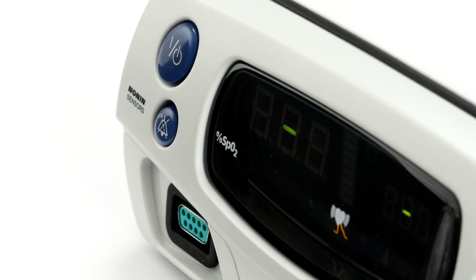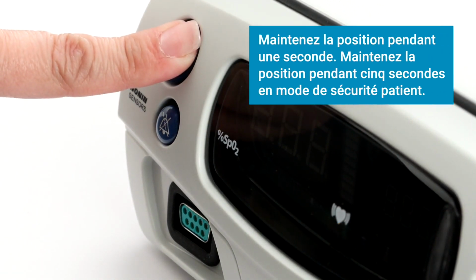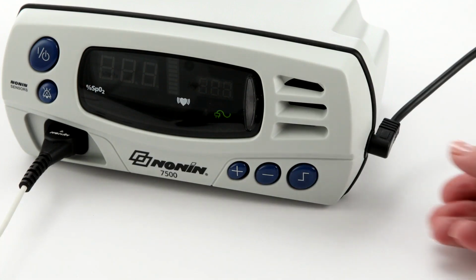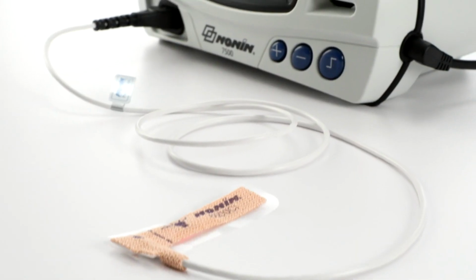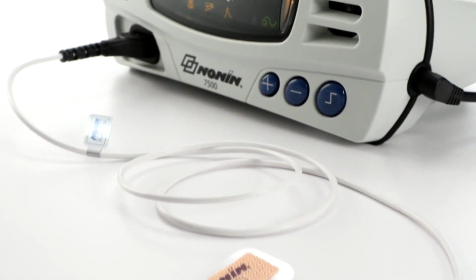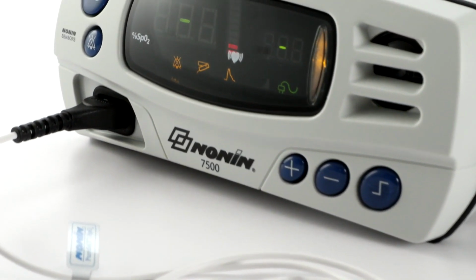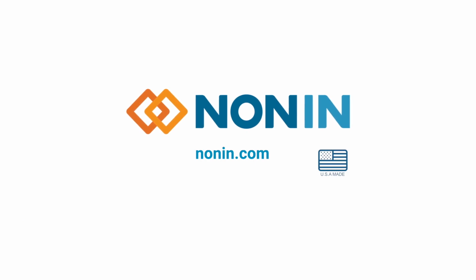When you're ready to stop using the oximeter, simply press and hold the on-off button until the oximeter turns off. Hold for 1 second in normal function and 5 seconds if the oximeter is in patient security mode. Then you can unplug and remove the sensor. With proper use, the Nonin 7500 pulse oximeter will provide consistent, accurate oxygen saturation and pulse rate measurement. You can find additional use information on this and other Nonin products at nonin.com.